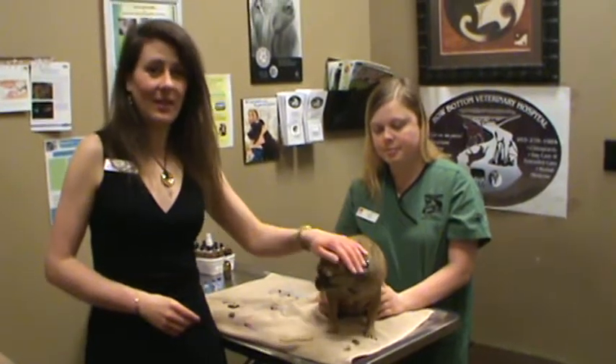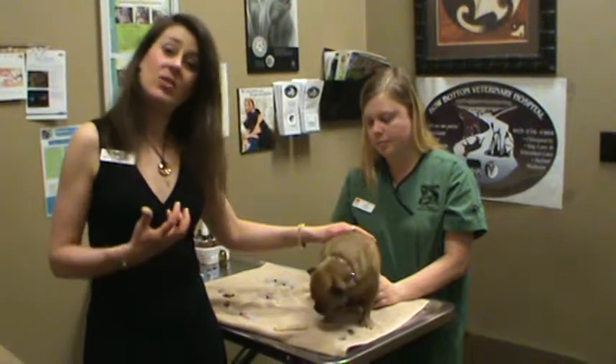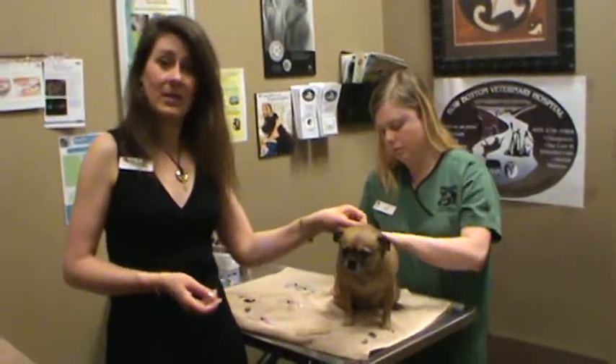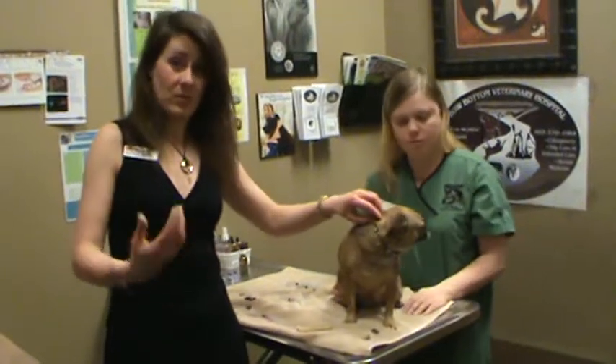Hello, my name is Dr. Julie Schell from Bow Bottom Veterinary Hospital and I would like to show you how to give an injection to a dog. This is great because often I will send my clients home to give injections to their pet. For instance, some arthritic dogs need a Cartrophen injection once a month or once a week.